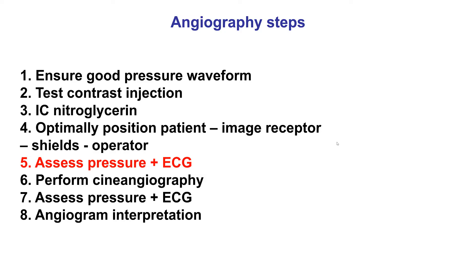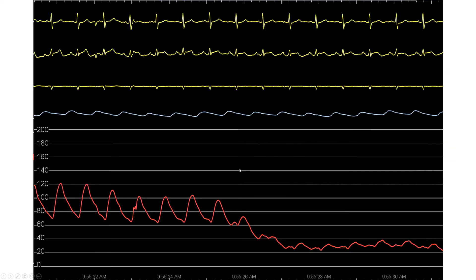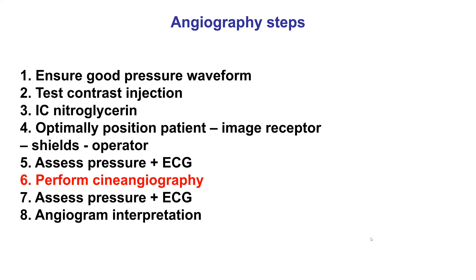Step five for the angiography steps is to assess the pressure and the electrocardiogram. This is done once again before the angiogram. We want to make sure there are no ST changes and that the pressure waveform is excellent, as we did prior to the test injection. Because if there is dampening, as discussed before, this can cause complications. Therefore, contrast should not be injected until this is corrected.